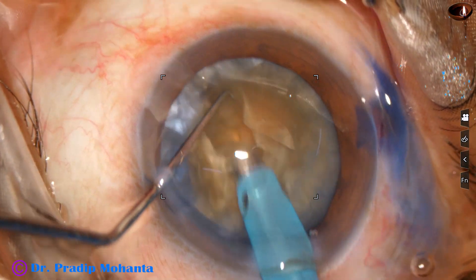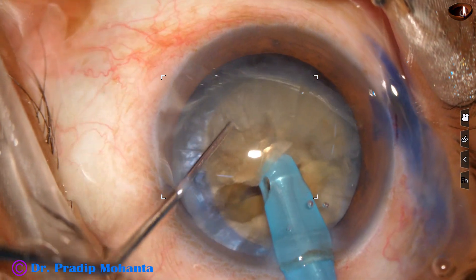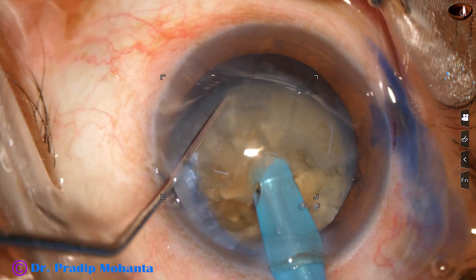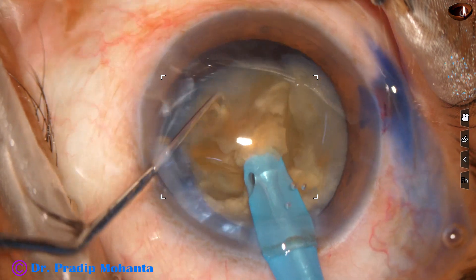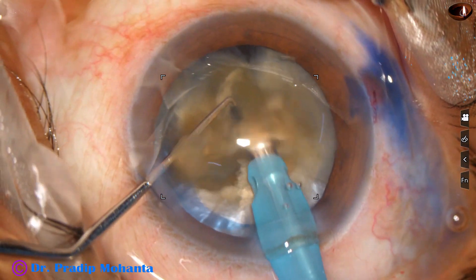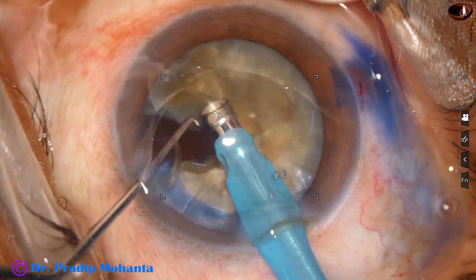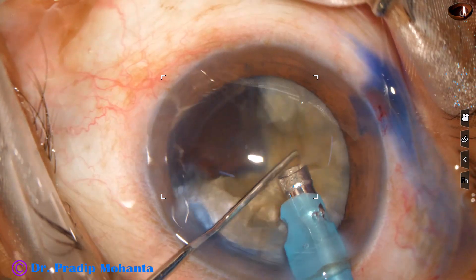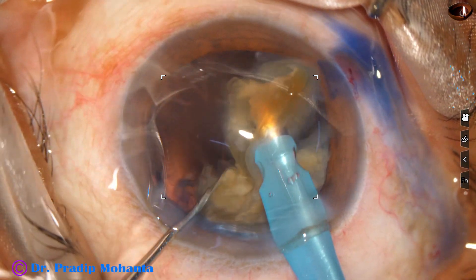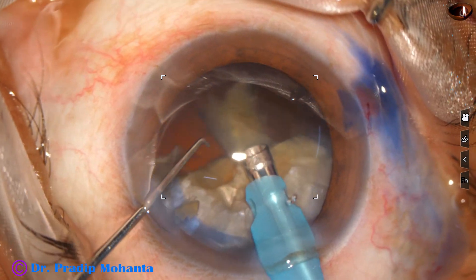Rotate the nucleus 180 degrees, go to a deeper plane and separate the two hemi-nuclei completely. Then chop this hemi-nucleus, tilt the fragment, subdivide it into two pieces and emulsify. Then go to the other piece, divide it into two pieces and emulsify.